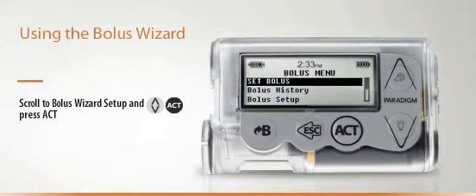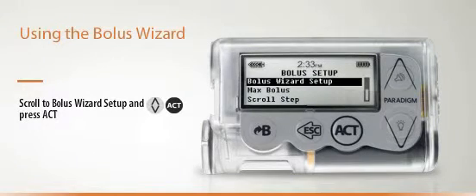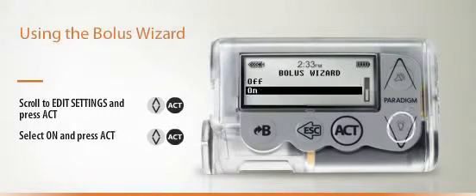To turn on the Bolus Wizard, scroll to Bolus Wizard Setup and press Act. Scroll down to Edit Settings and press Act again. You will now see Bolus Wizard On or Off. Highlight On, then press Act.